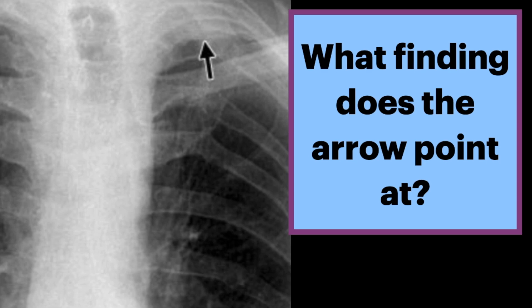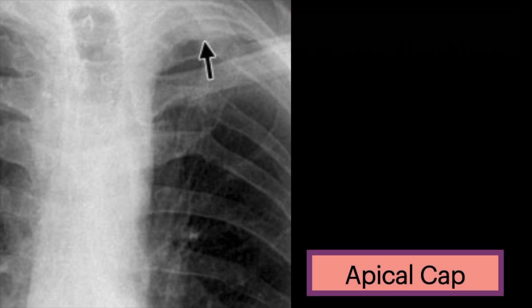What finding does the arrow point at? We see a crescentic opacity with an irregular border projecting over the left lung apex on this frontal chest radiograph. The answer is an apical cap.